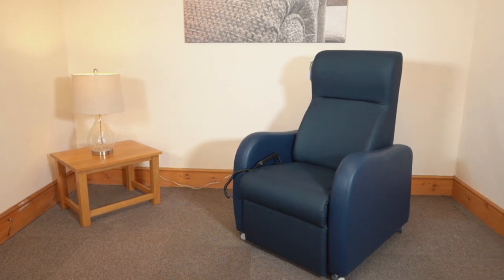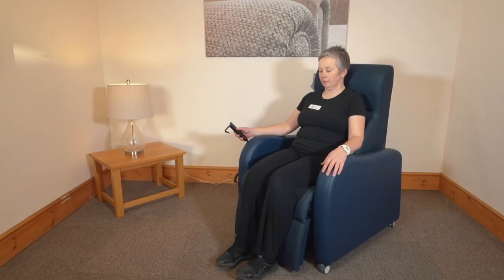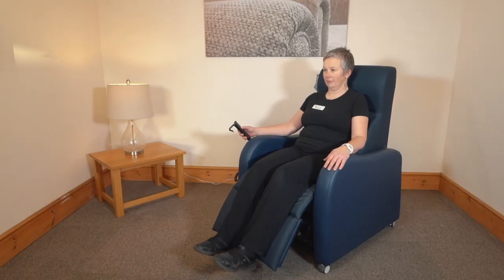The Stamford comes in one size and it is designed for general comfort. This chair has limited seams and simple lines to assist with infection control processes.